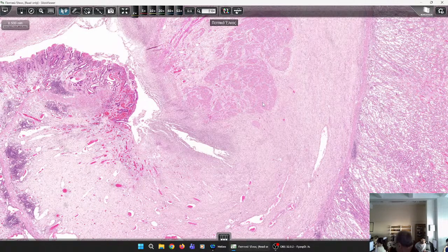It is displaced because this fibrous tissue shrinks the area, so it might lead to a complication named pyloric stenosis. And so the food cannot go to the duodenum, and there is vomiting, rather explosive vomiting of the patient.